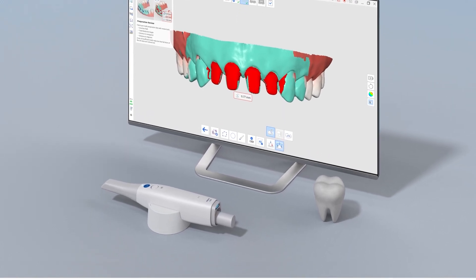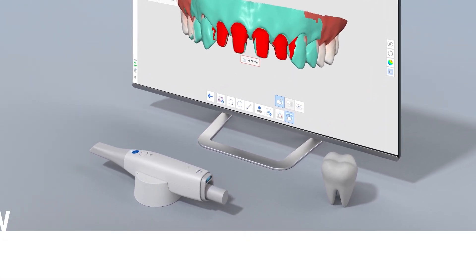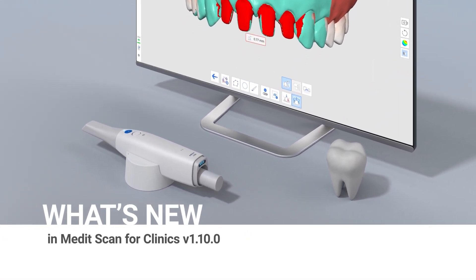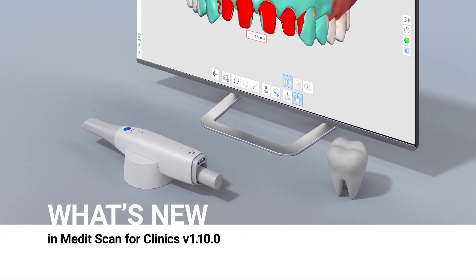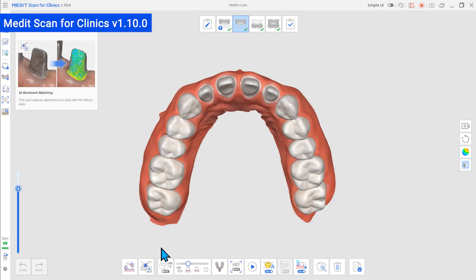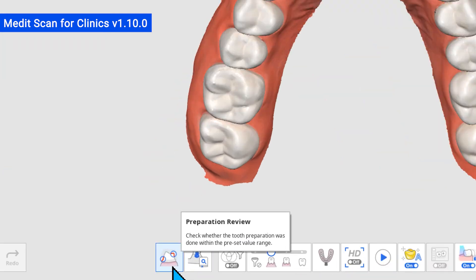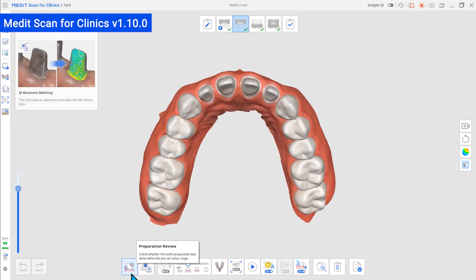We'd like to introduce the updated version of MeditScan for Clinics. In this update, you will find several new and exciting features, and one of them is the preparation review.